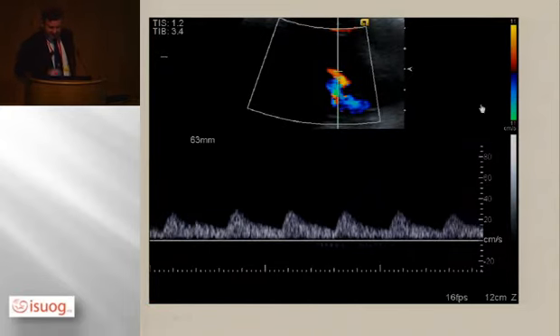And you can see that in this image. This is a perfectly nice waveform, but it's not an acceptable waveform. And it's not acceptable because if we look at this angle here, it's probably about 50 or 60 degrees. I haven't actually measured it, but it's about 50 or 60 degrees. And that means that of course, you can change the scale here, but the quality of the waveform will never be brilliant. So try and bring that angle down as much as you can.